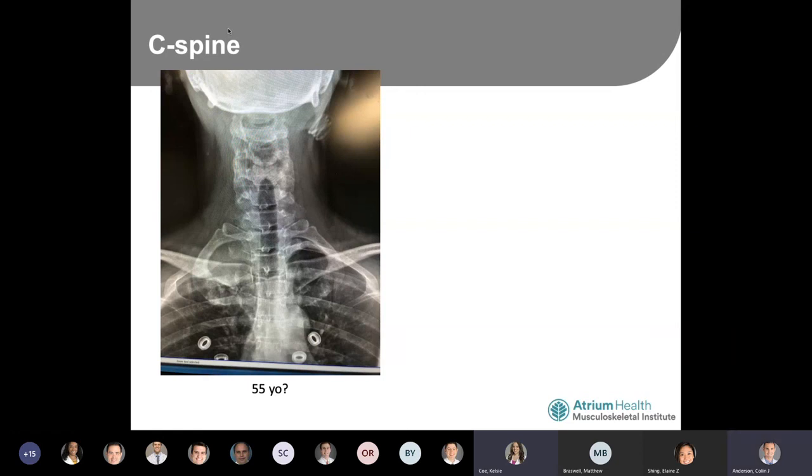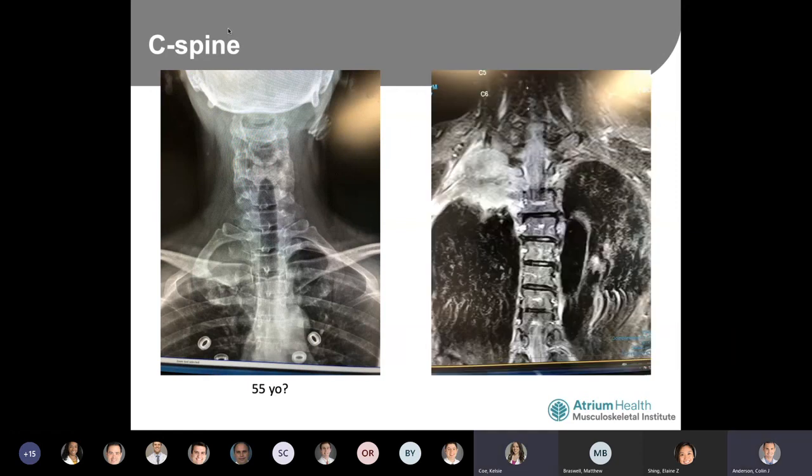From what I can see, the anterior aspect of the first rib looks like there's kind of an expansile lesion. It's a little bit difficult to tell with the overlying lung fields and the subsequent ribs and the clavicle, but I think that's the asymmetry. And it's actually the second rib. The right second rib posteriorly has disappeared.